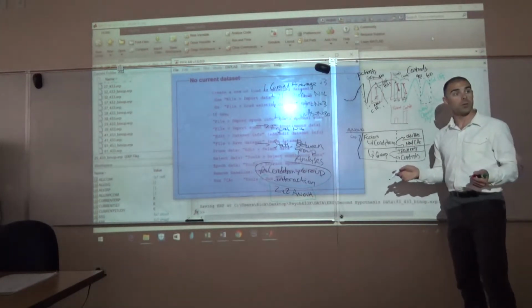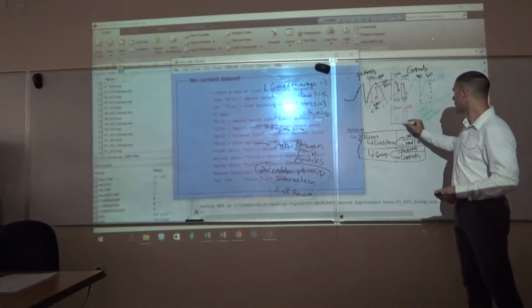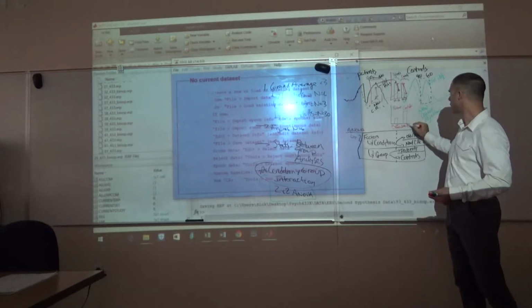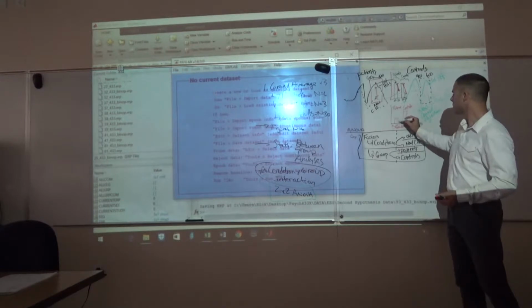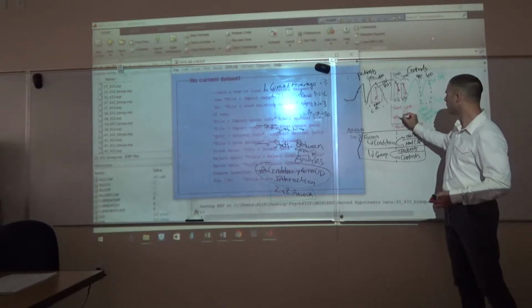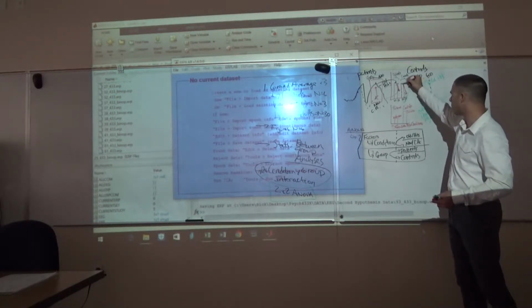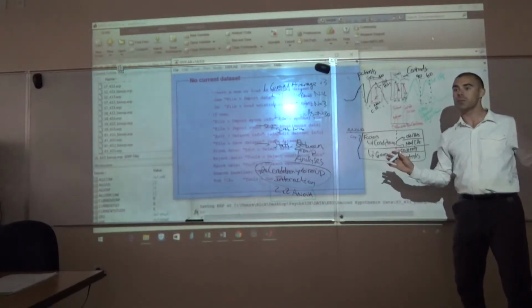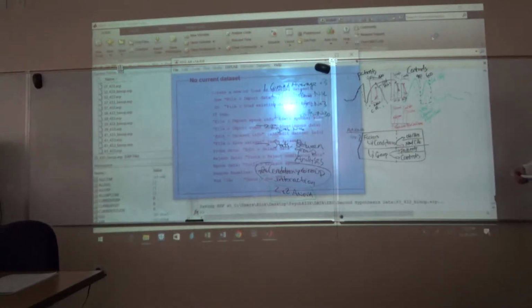What we're going to do, okay, is now, this is our difference, right? This is basically your difference between conditions, right? This is your old minus new, and old minus new, right? So you're subtracting how much space is there between the old and the new amplitudes. Does everybody feel like they're on board with this idea?